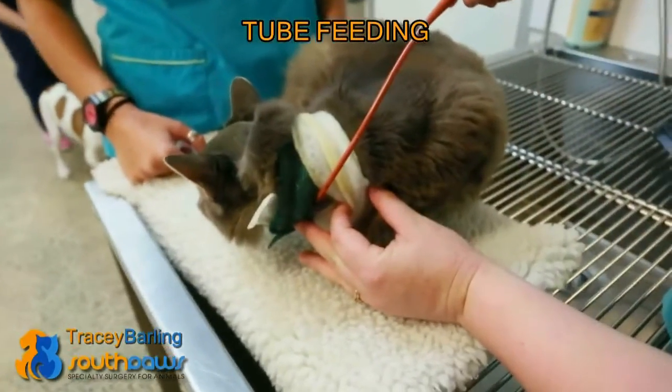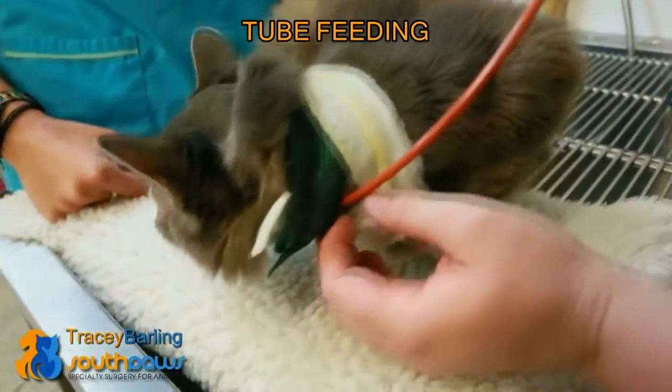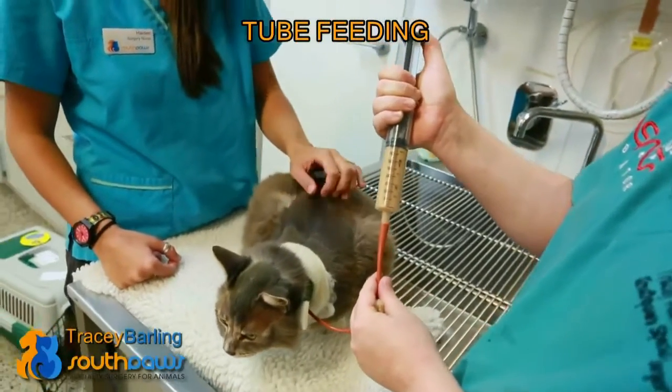The feeding tube is going in through the side of his neck under the bandage here, down into his esophagus and into his stomach. So we'll feed him through the feeding tube.